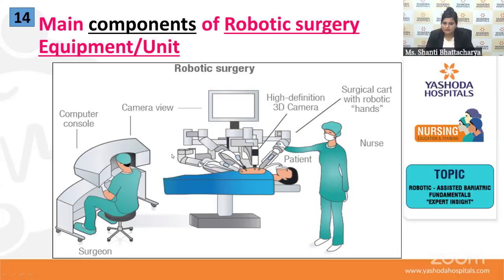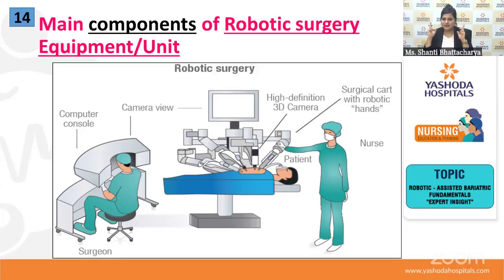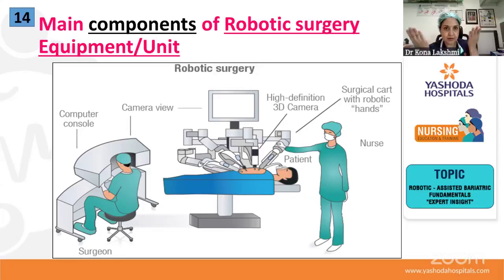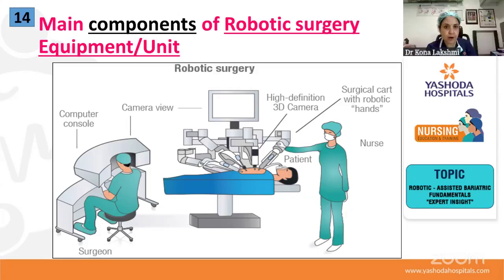Now we are able to see like this. But if your eye allows you to see this side, peripheral focus, you are able to see what is happening here, right, left, in a curved fan. So you know that I am operating here. What is happening to the organ this side, and that side, is entirely under my vision.